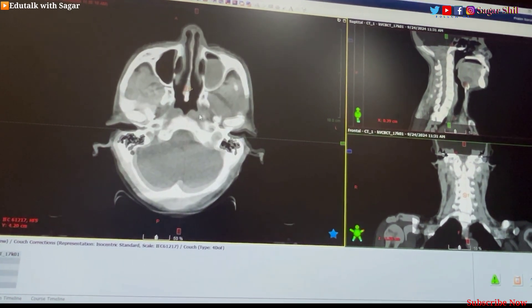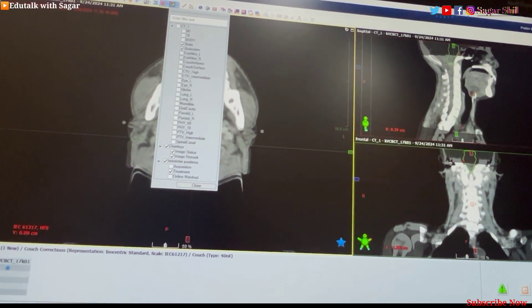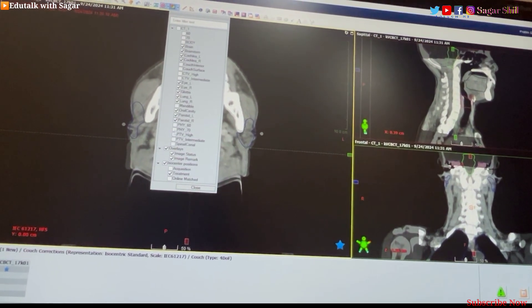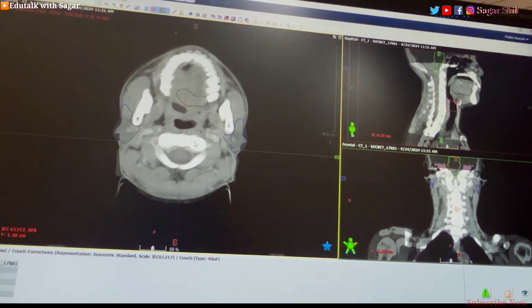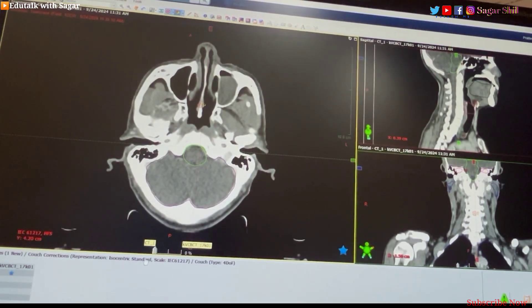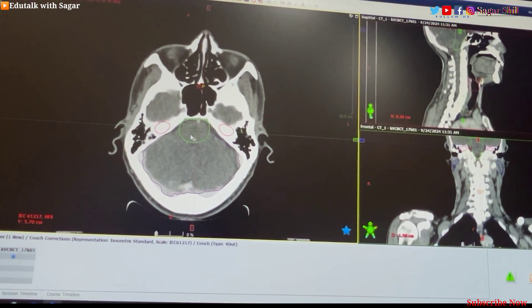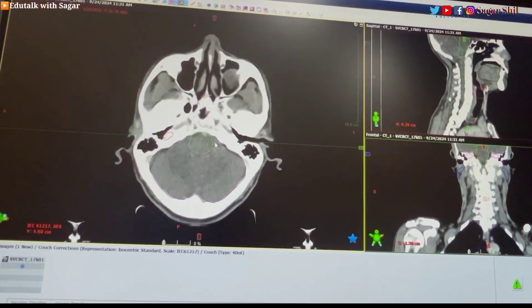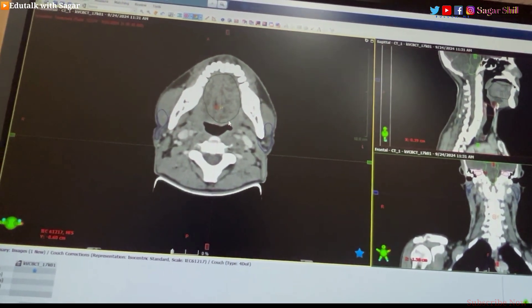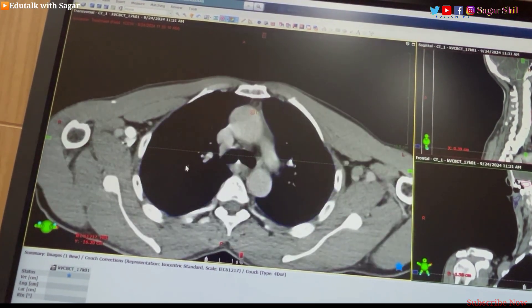Here I am showing the OARs in a head and neck case. This is the CT image and this is the CBCT image. In the CT image you can see the whole brain, the brainstem, both cochlea — right and left — the parotid gland, oral cavity, larynx, and both lungs. These are all the OARs we need to be aware of during CBCT matching.